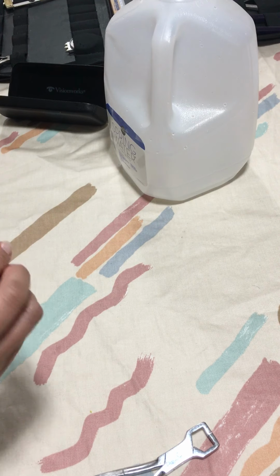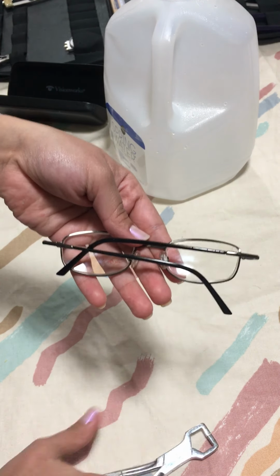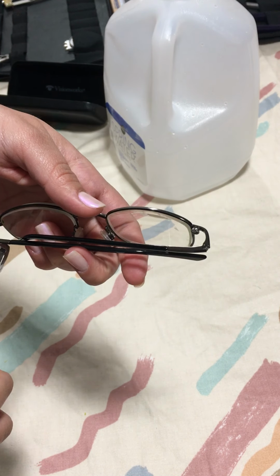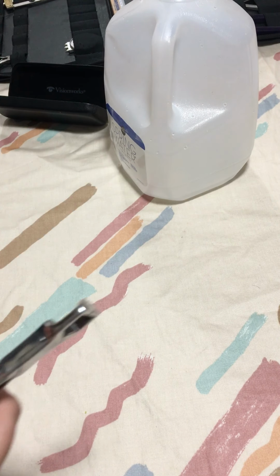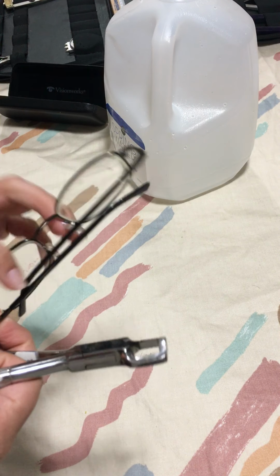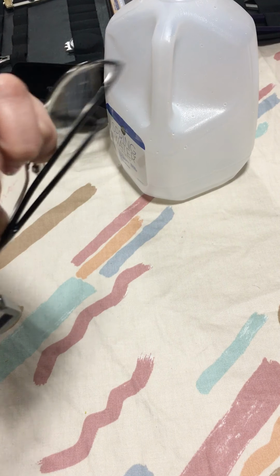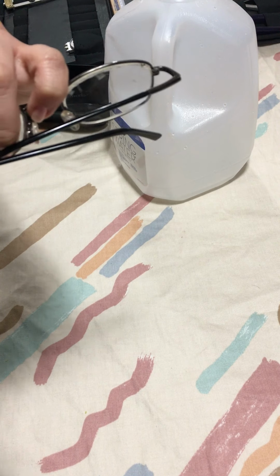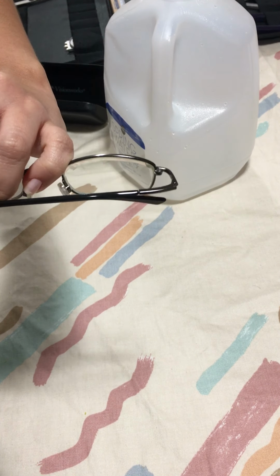I'm gonna go like this. Okay, and what I'm gonna do is, since this one is going down with temples closed, with my wide angling plier I am going to grab onto it here to apply a little bit of pressure. Okay, right here to apply a little bit of pressure. Temple still closed. What I'm gonna do is I'm gonna raise it upwards. So I'm gonna raise up.